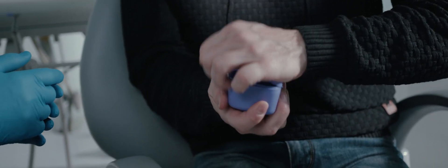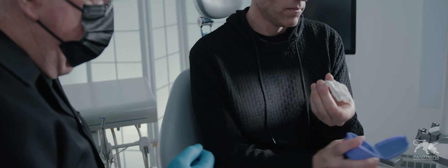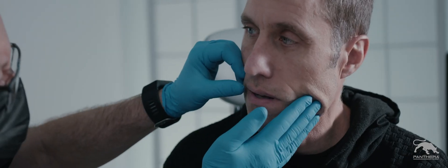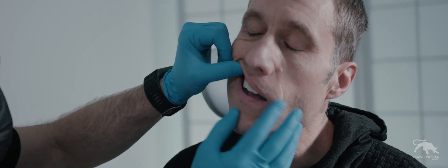When a patient's oral appliance causes pain in one or more areas of the oral cavity, adjustments are possible by removing material.